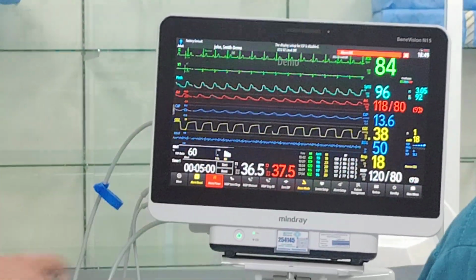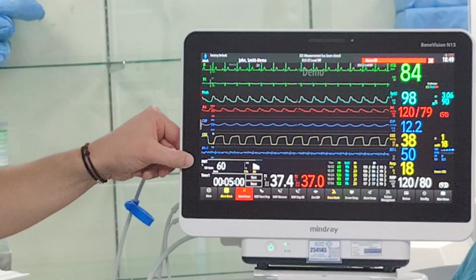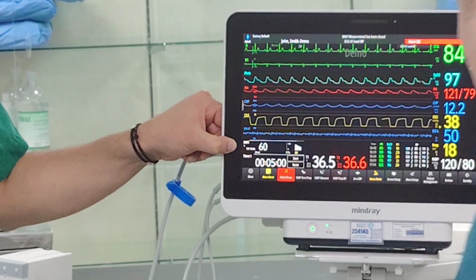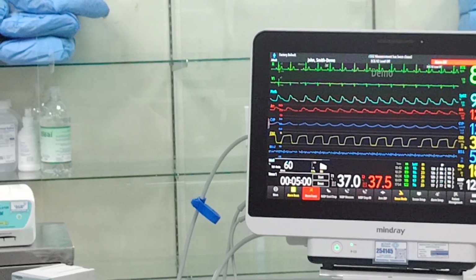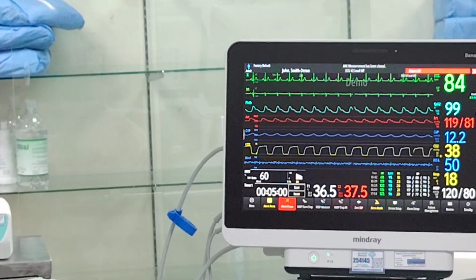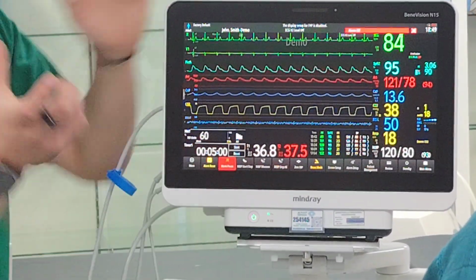Okay, now what are the measurements? It's like any NMT. I'll explain a little bit. You will see two phases. Number one is percent, then you will see something called count. What does it mean? When the patient is not yet relaxed, in the beginning normal, it will give the percentage. The percentage looks at T1 versus T4 and sees the difference.